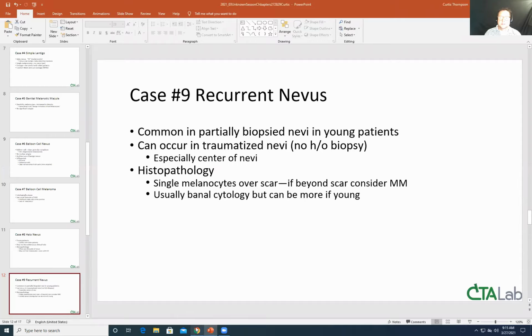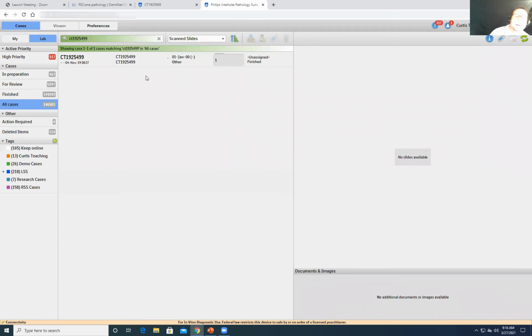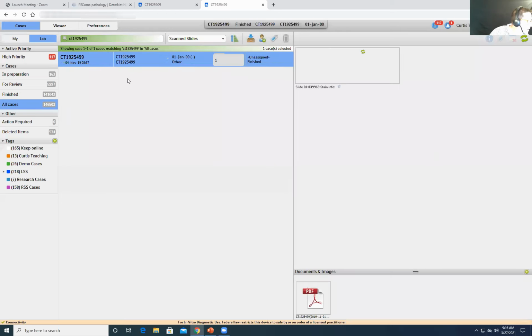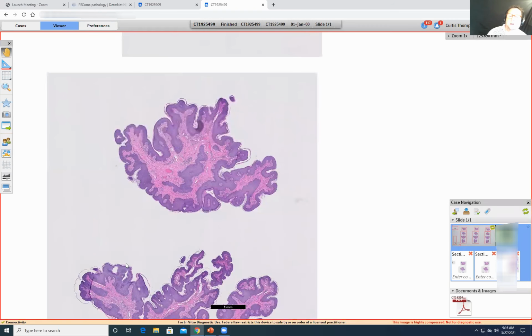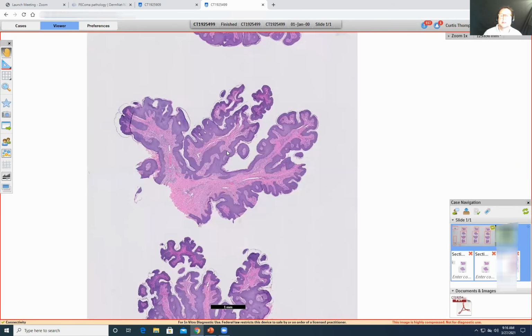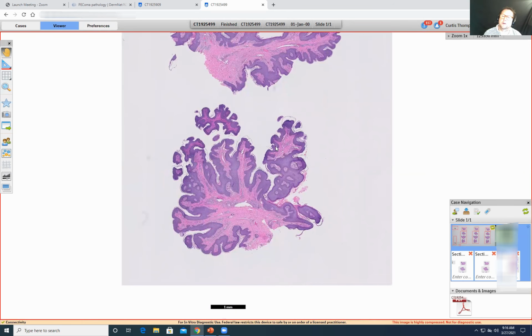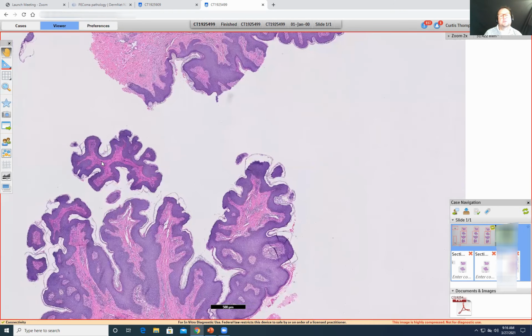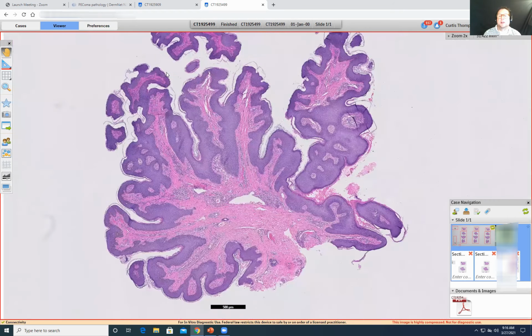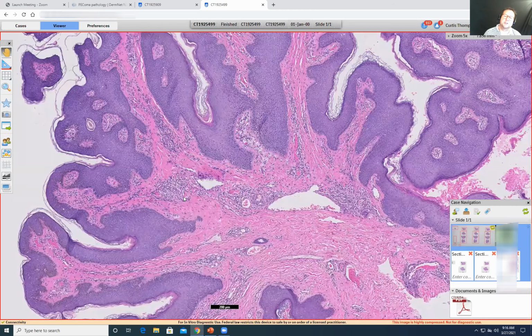All right, so next case is number 10. 8-year-old male with a polypoid lesion on the lateral neck. Immediately looks like a sub-K, right? A papillated sub-K, the nice squared off digitations, crenations like in a castle. That's what you like to see for sub-Ks, but the patient's only 8, right? So it's not a sub-K, it's an epidermal nevus, and a little bit of fibrosis here and lymphocytes.